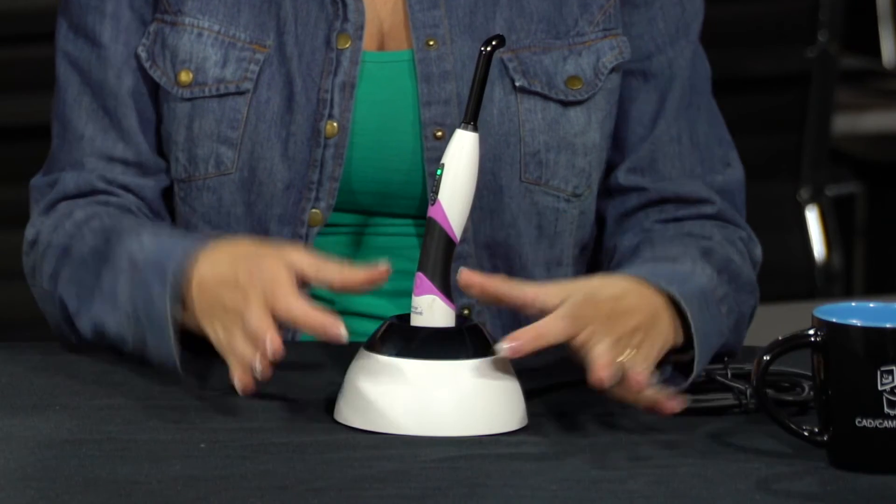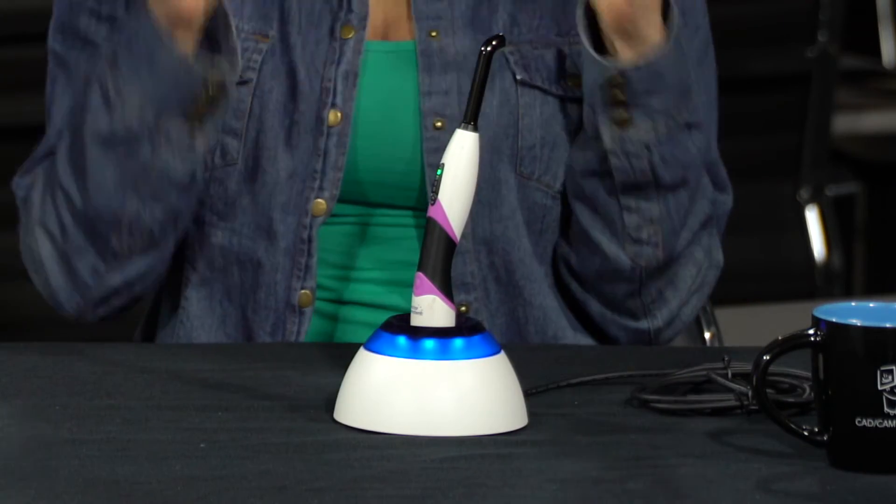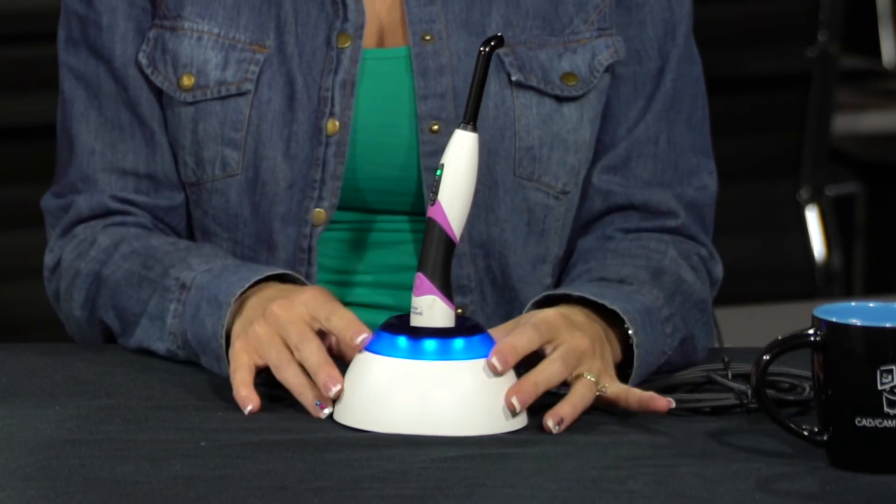Ivoclar Vivadent has made a really neat charging station for the Blue Phase light — they really thought through every scenario in the dental office. With old-style lights, if it's not seated right in the station it's not charging. With this one, it has an illuminated ring of light around it that flashes to tell you it's on the station, and when the ring is fully lit you know it's charged. At any time I glance over, I know my light is charged.